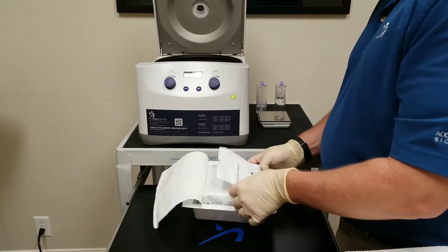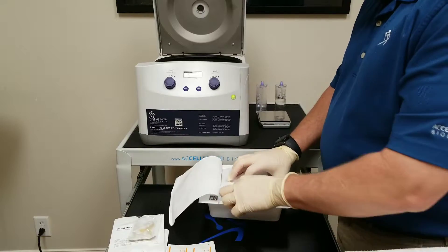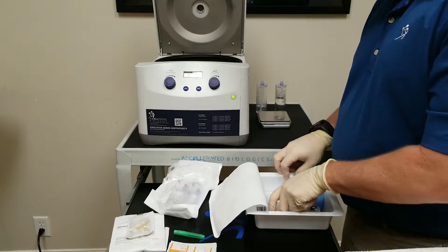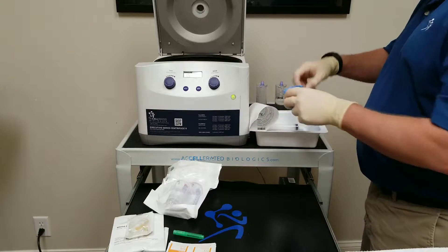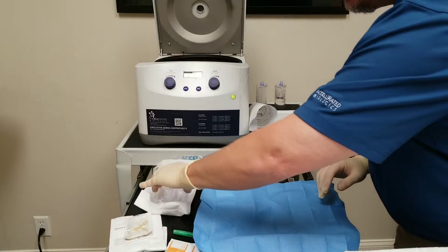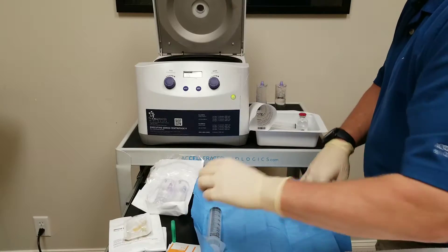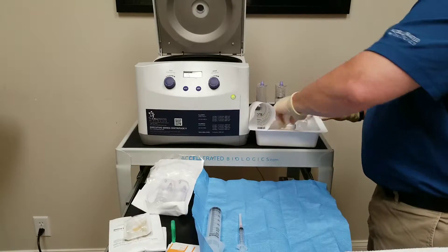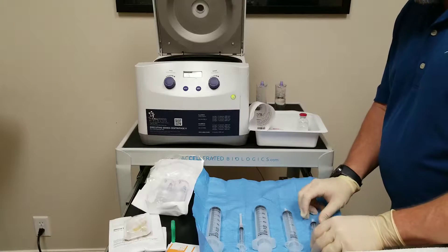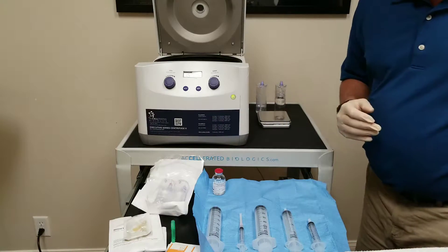When you open it up, every kit you will have your blood draw accessory, 19 gauge butterfly needle, alcohol swabs, filter needle, processing devices, a sterile blue drape that can be placed on your workspace, and a sequence of syringes: 60 ml, 3 ml, another 60 ml, 30 ml, and your final syringe will be a 12 ml syringe. There will also be a 20 ml vial of sodium citrate anticoagulant.